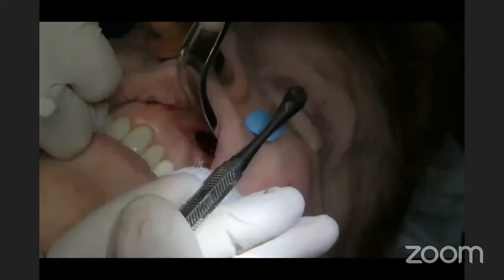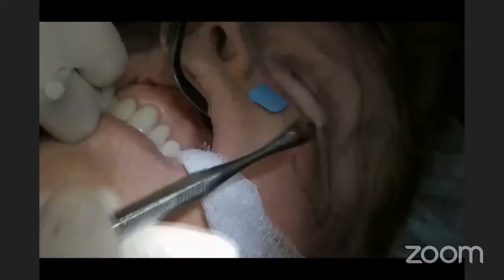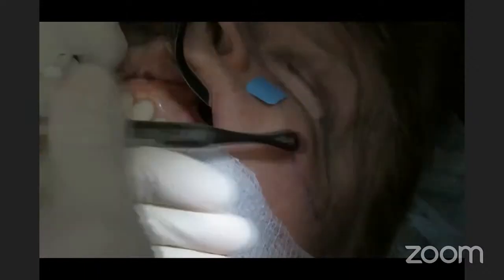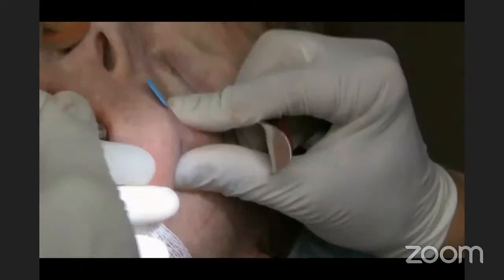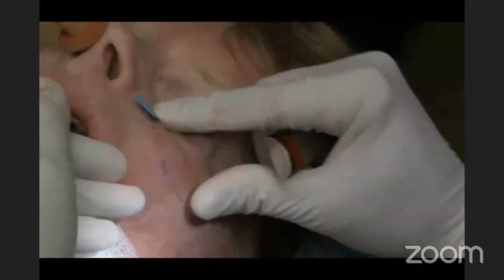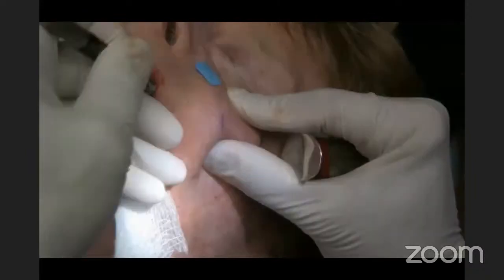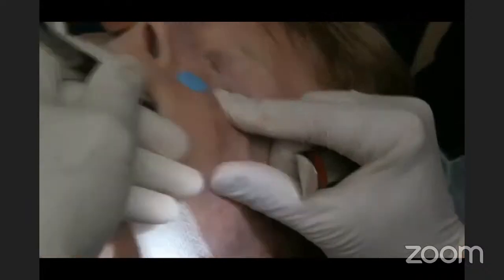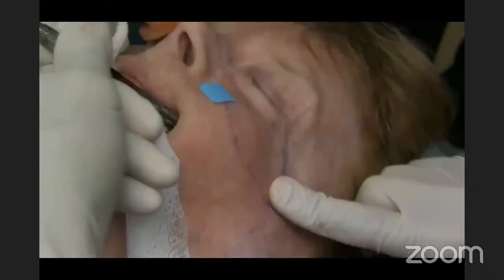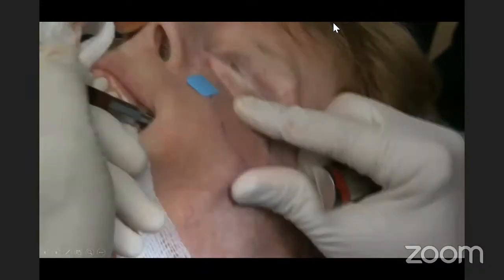Now we're taking a periosteal elevator, and our initial dissection is superior, but we have to stop because we don't want to hit the infraorbital nerve. So after about a centimeter of superior dissection, we're going to angle our periosteal elevator obliquely and dissect in that vector out towards the frontozygomatic suture. So I'm placing a finger to protect the orbit, and my thumb is on the other side of the frontozygomatic region. And depending on the implant, we're generally dissecting out into this region. Again, this has to be subperiosteal.